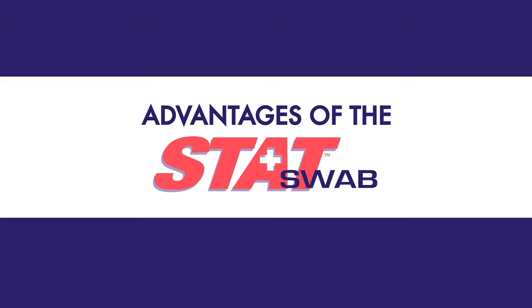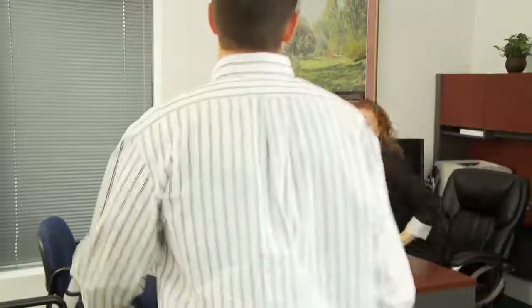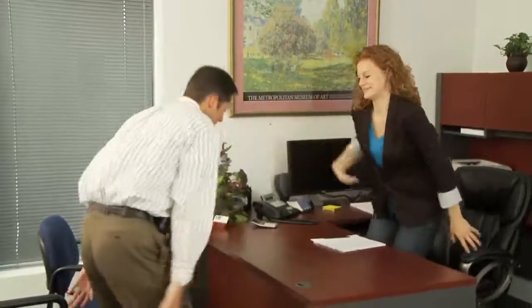Advantages of the StatSwab. There is no need for a restroom as StatSwab testing may be conducted in an office or in the field. Sample collection is observable, reducing the instance of test tampering. Oral swabbing also eliminates the privacy issues associated with urine testing. StatSwab offers a simple swab and read procedure. The device may be shipped to a lab for confirmation testing.